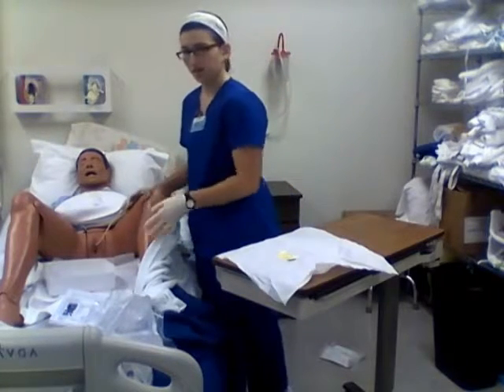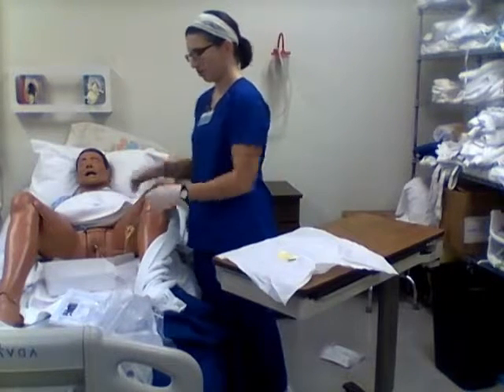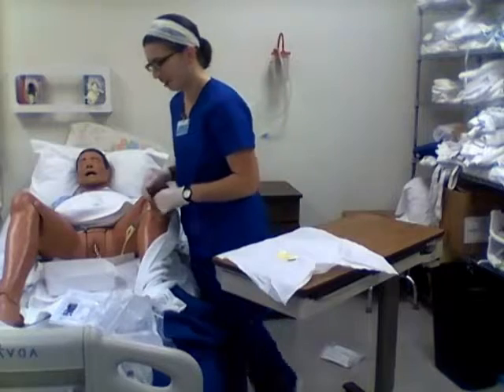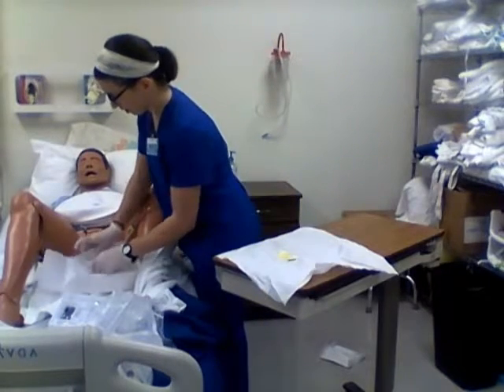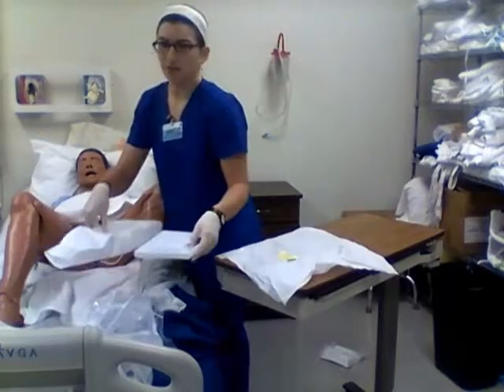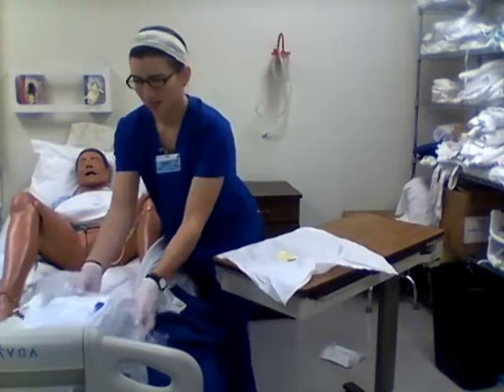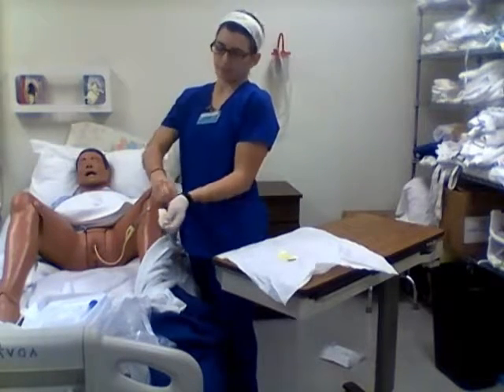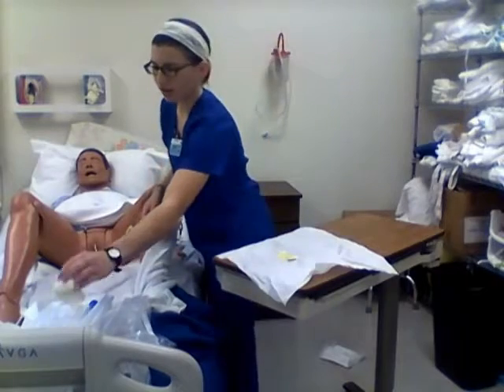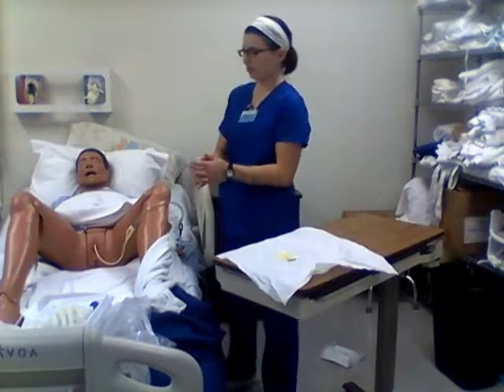So now that we're all done, she's all strapped up, all ready to go back to doing whatever she was doing before I entered the room. So now I can go ahead, I can get rid of all of my garbage. So I can go ahead, throw everything in the trash can. I'm not actually going to because we reuse this a lot, but I would throw it away into the trash can. I would immediately discard my gloves. And right after doing that, I would perform hand hygiene once again.